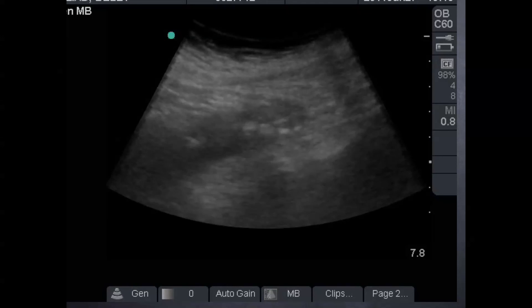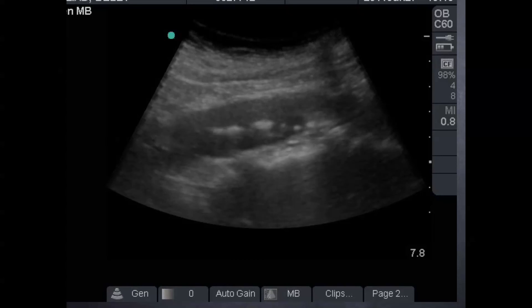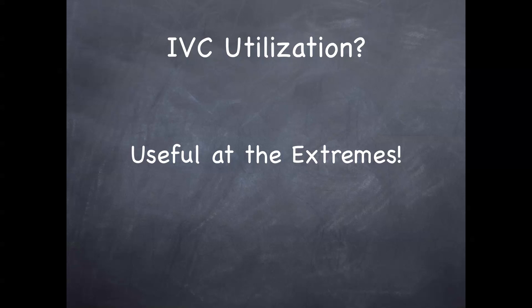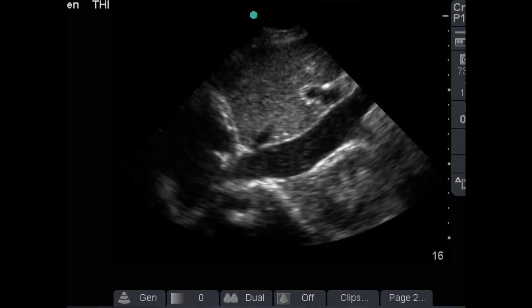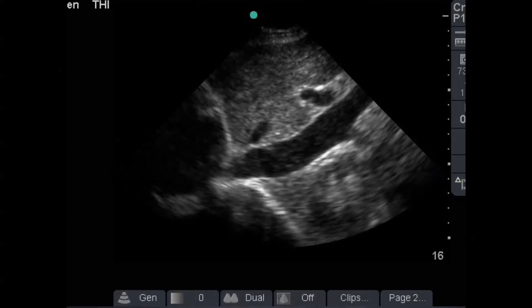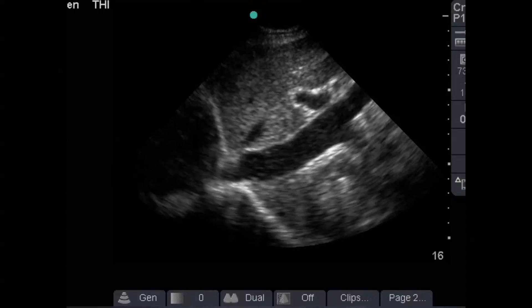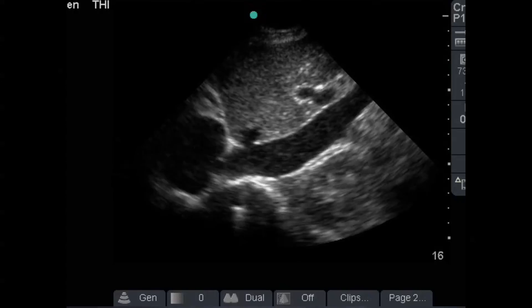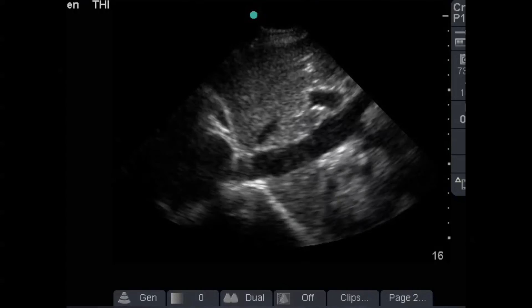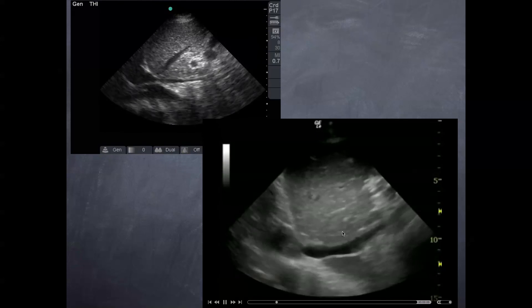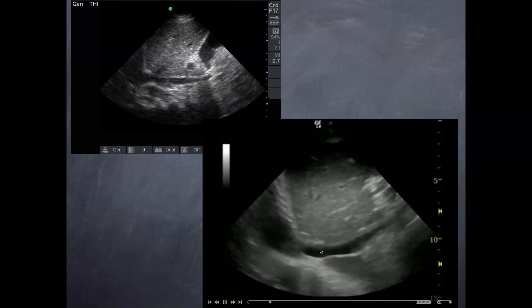Close up — nice longitudinal view, large dissection. Just to reiterate IVC utilization: I use it at the extremes. Big and plump means non-fluid responsive. Dynamic and compressible means yes, fluid responsive. Here's a pretty plump IVC with not much compressibility with respirations — this patient probably is not going to respond much to fluid. If they are hypotensive, you can give a trial and see how you go, but this patient is going to need a little more boost. As opposed to these patients here where the IVC walls are essentially kissing one another — this patient is fluid-down and needs IV fluids.